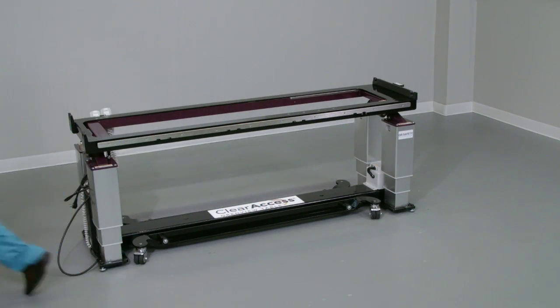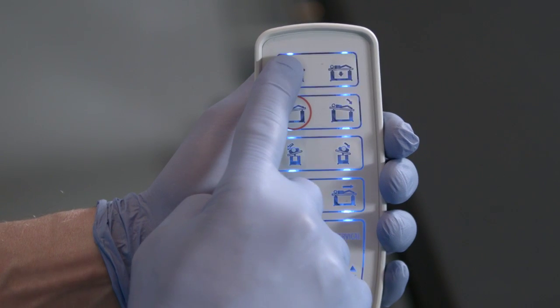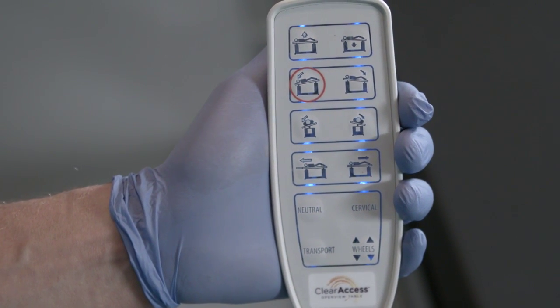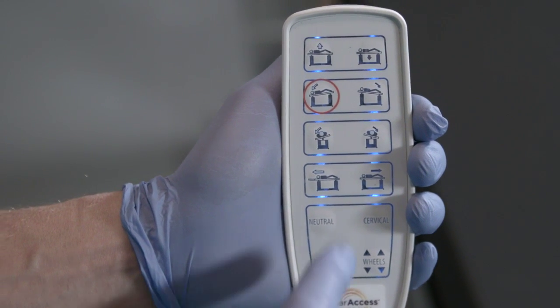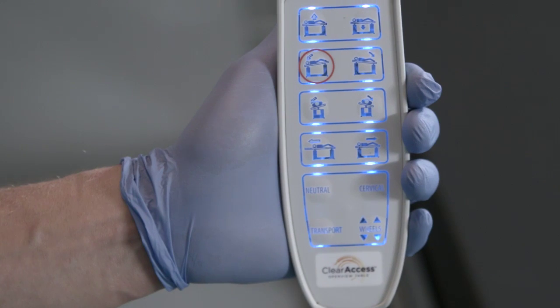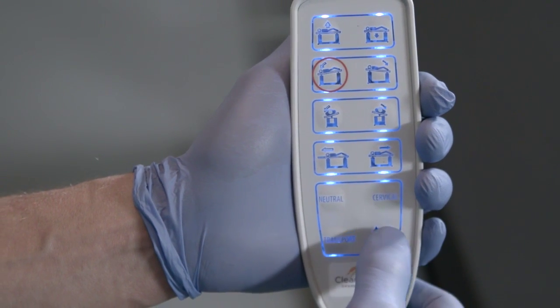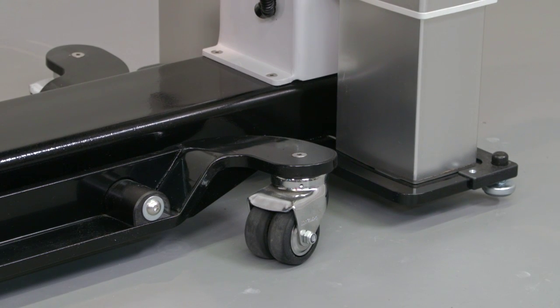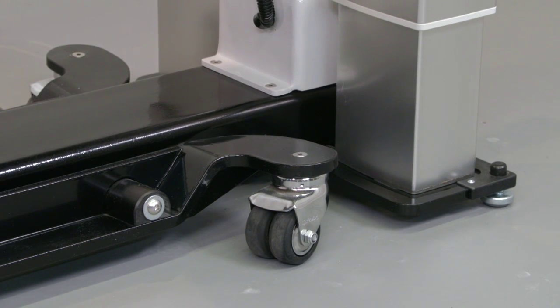To lock the table to the floor, press any button on the hand controller to wake it. Both hand controllers will auto-sleep if inactive for 30 seconds. Press any button to reactivate, and then lock the table by pressing the wheels button firmly once and releasing. You'll note an audible beep as the table is lowered to the ground, warning caregivers to keep personnel and equipment clear of the table.